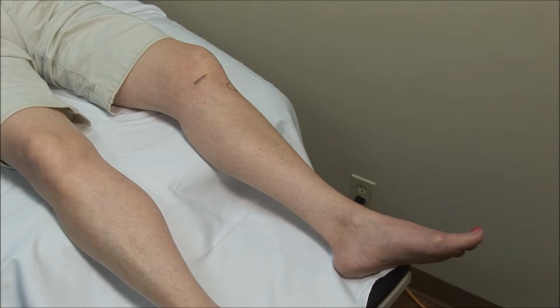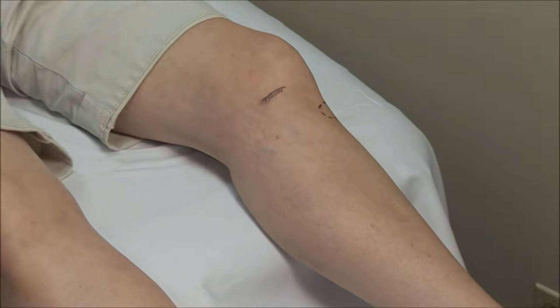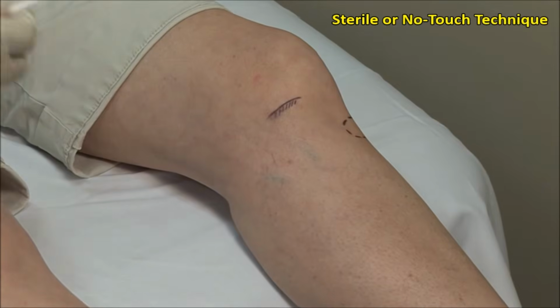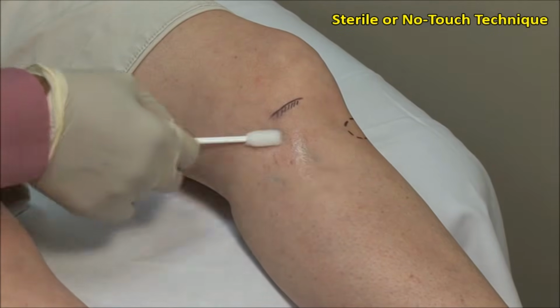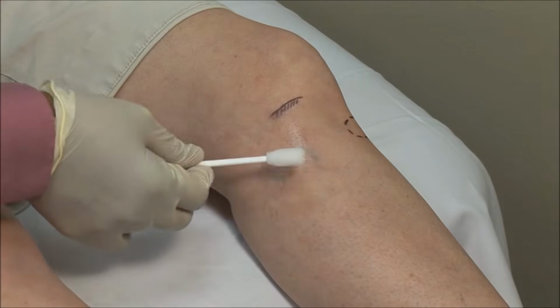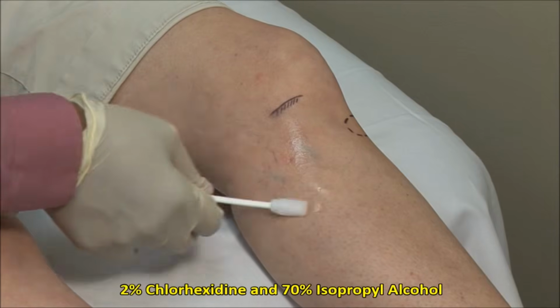Injections of the anserine bursa are done with the knee slightly flexed and the leg externally rotated a little. These injections should always be done using sterile technique. Scrub the site and then clean in an outward fashion. I am using a mixture of 2% chlorhexidine and 70% isopropyl alcohol.